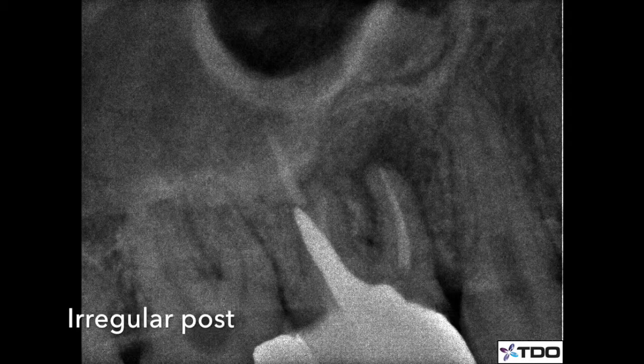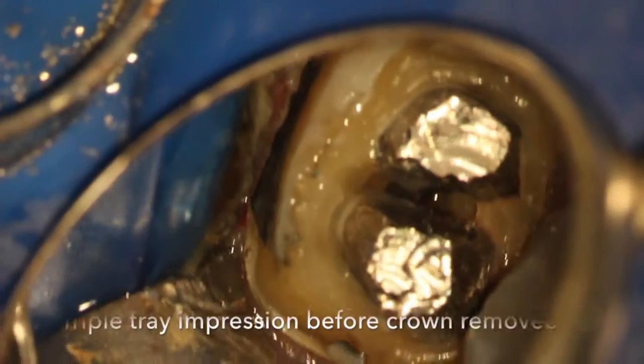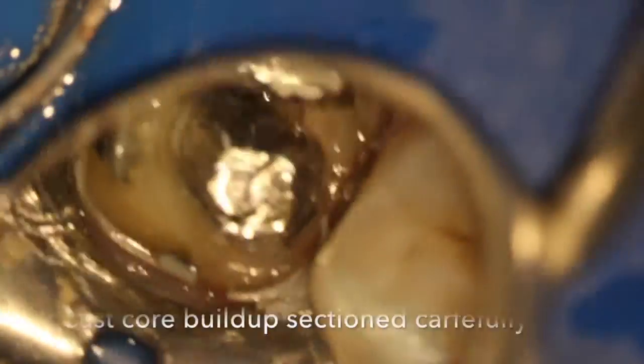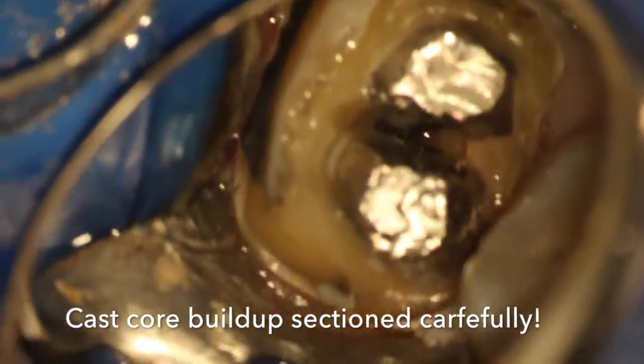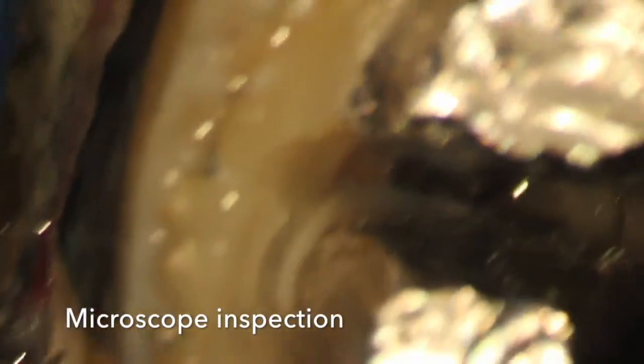You can see on radiographs there's a radiolucency, an open margin, and looks like an irregular post-buildup pattern. Bite wings are really important to assess these cases properly. A triple tray impression was taken preoperatively. Then the PFM was sectioned with diamond and cross-cut transmetal burs.